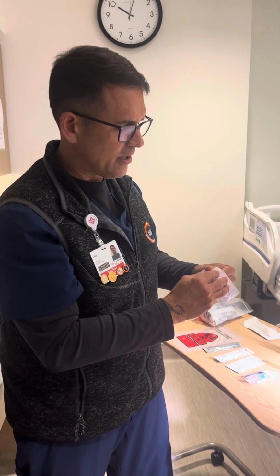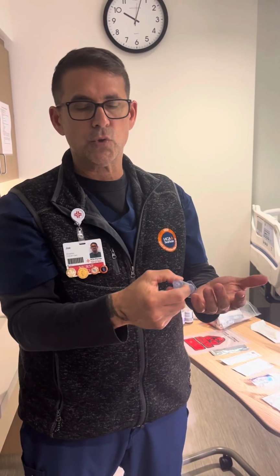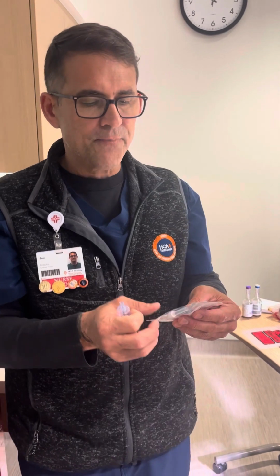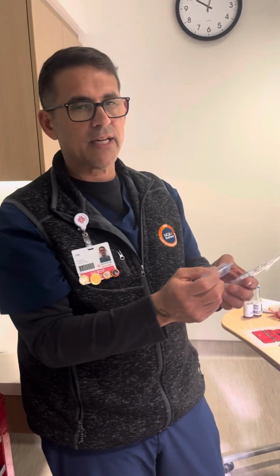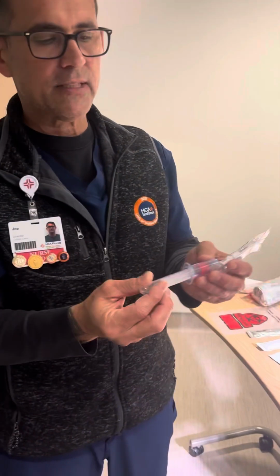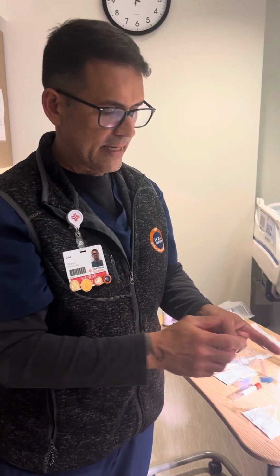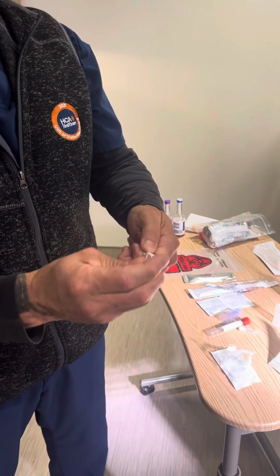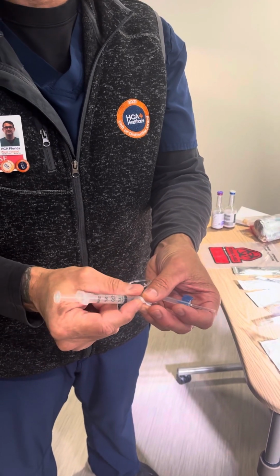This little transfer device here can be used in a couple of different ways. You can have your blood and hook it up here and poke the tubes if you want to. But on most kids less than 6 or 8 years old, if you're gonna stick them with a smaller butterfly needle like this one, you should not be using the vacutainer directly to the tubes. If I hook this up with this setup, I'm gonna collapse that vein and you're not gonna be able to get any blood. So what you should do is open this little piece up, take off this part right here, and hook up your syringe directly to this hub. Now you can control the flow of blood out of that vein instead of hooking up the suction right here. I hope that makes sense.